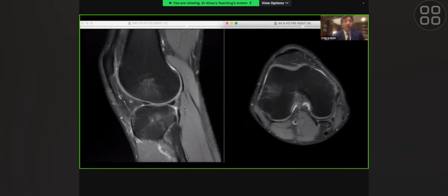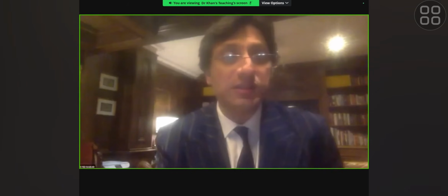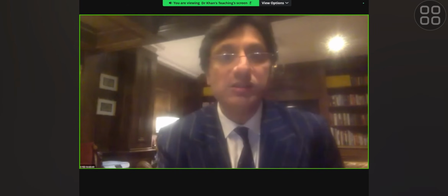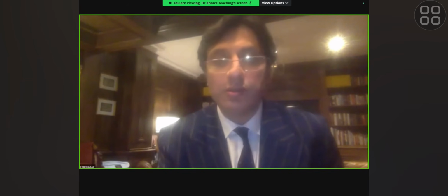So in order to confirm, we have to look at the CT. I've just stopped sharing because I need to bring up the CT of this patient. Oh, hang on.